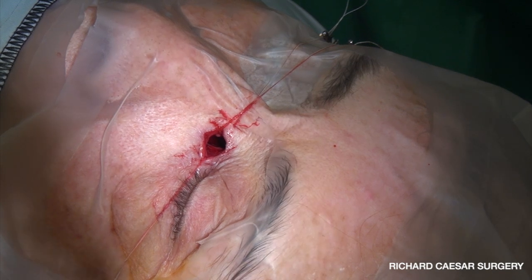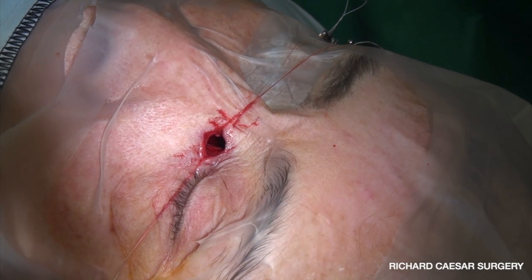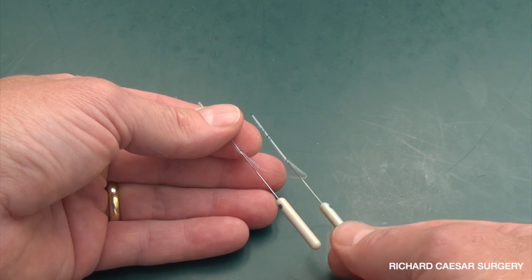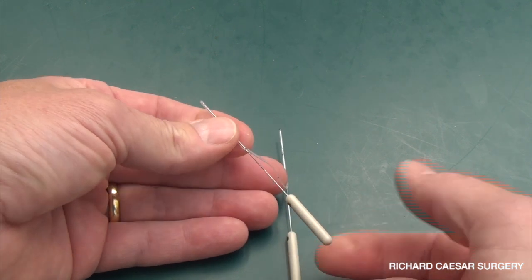I'll keep you informed as to how easy it is in clinic and how well this stays in position, but so far so good. So while I reinsert the Nunchaku, let me explain.